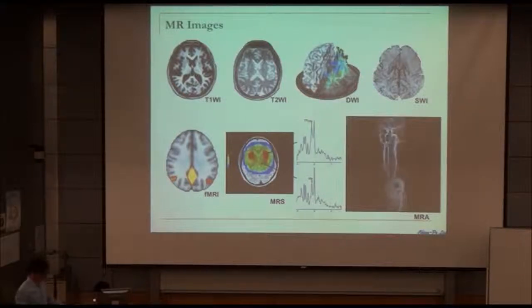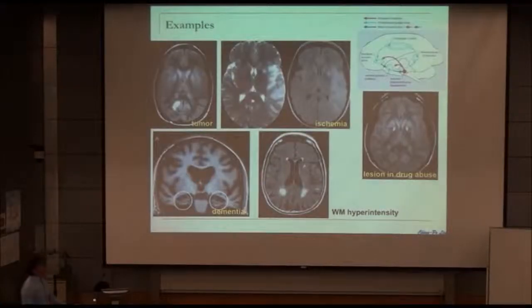So we need the lecture. And this is an example of anatomy used for clinical study. For example, when we have the anatomy information for tumor patients, we can easily identify the tumor region, or for the patient with ischemia. And MR is nowadays the most standard technique to identify ischemia. Within 20 minutes, we can actually identify the region, as usual here.